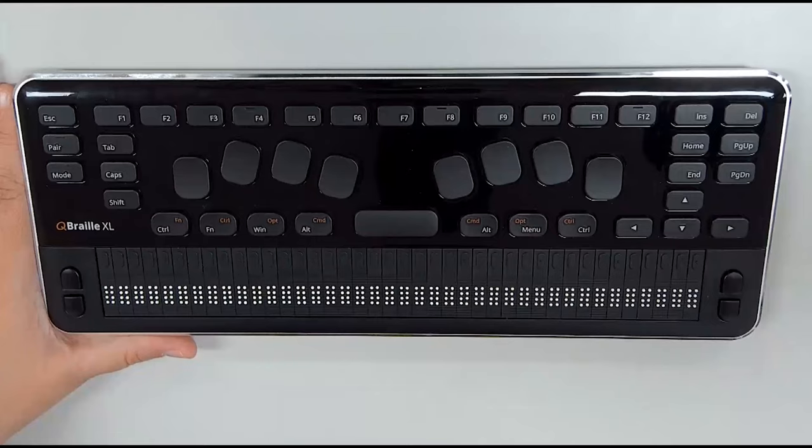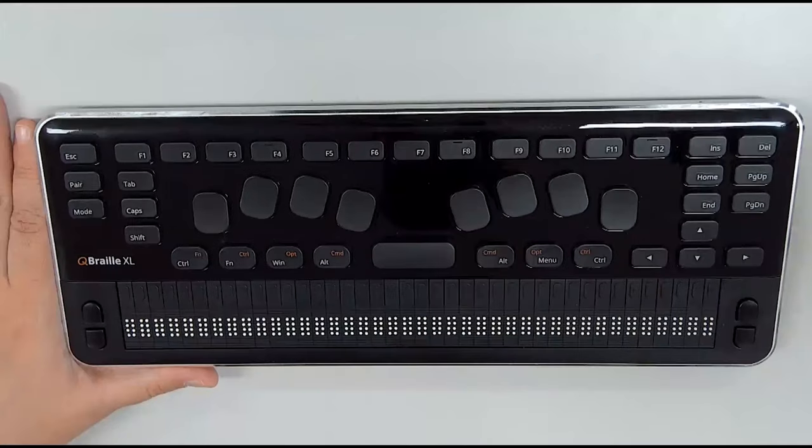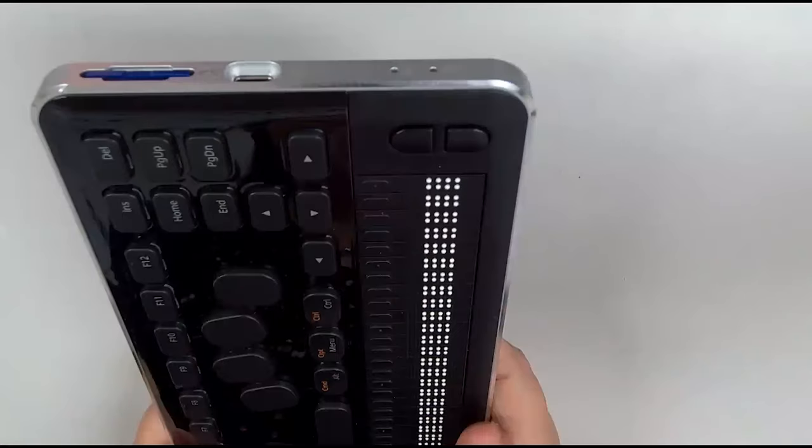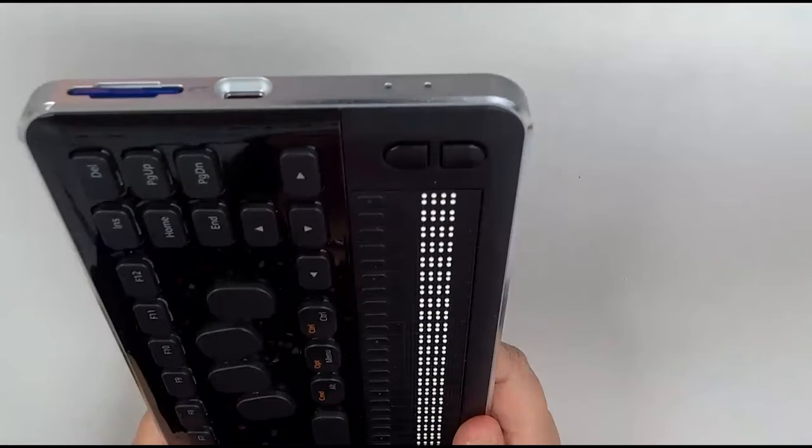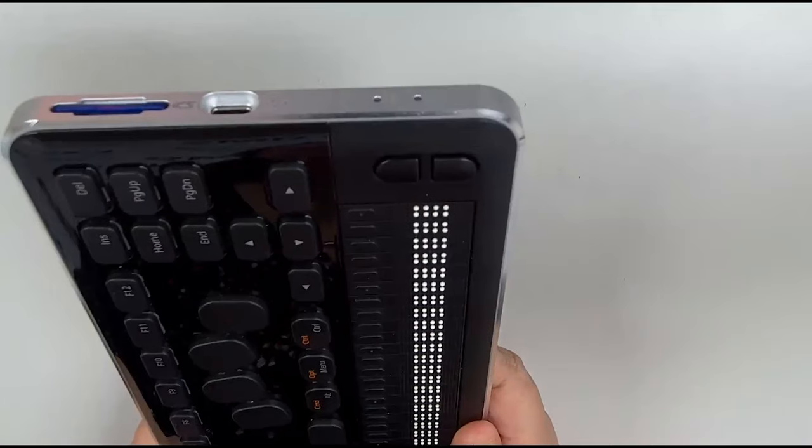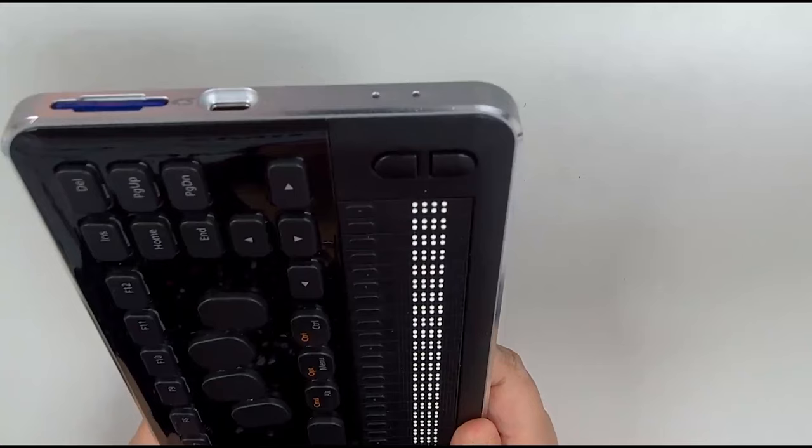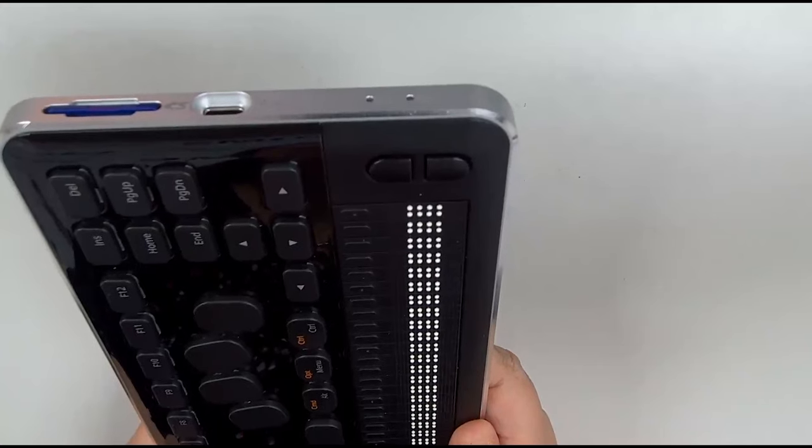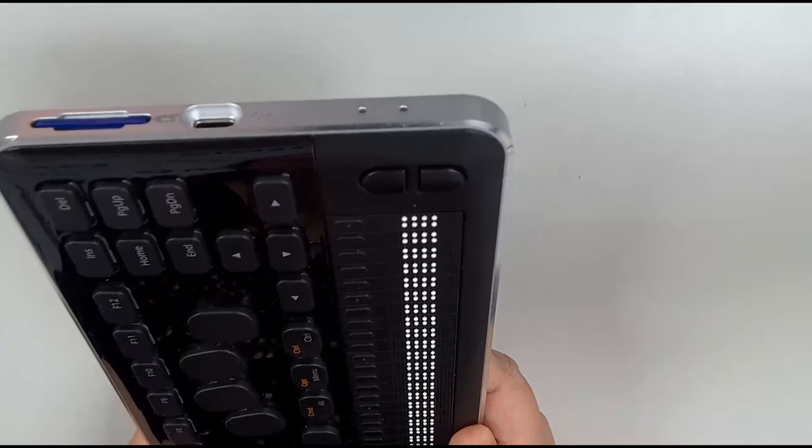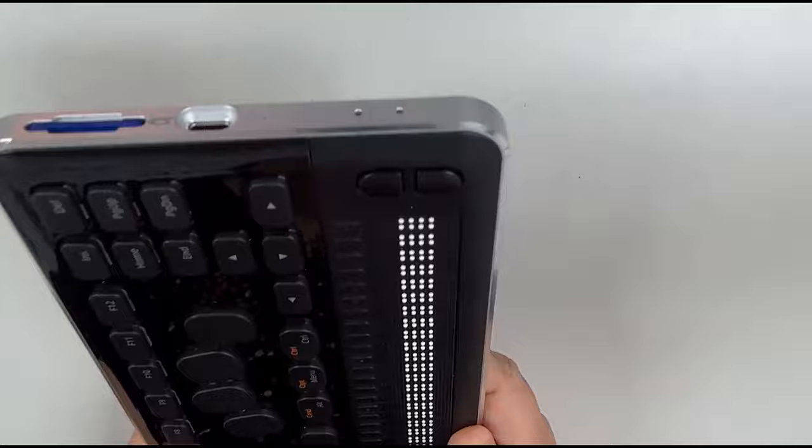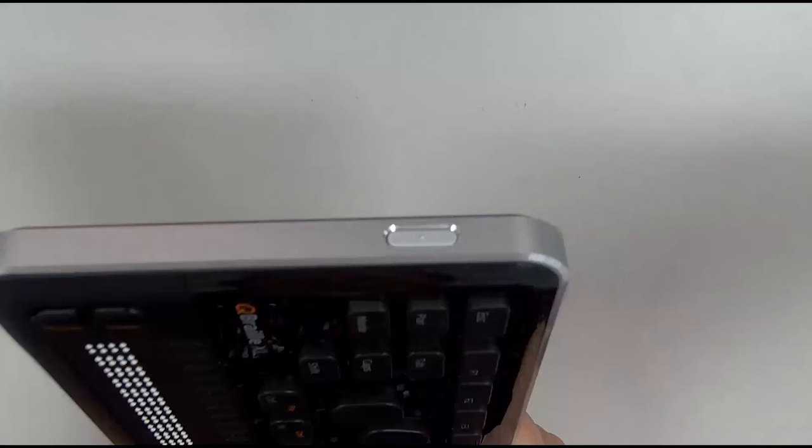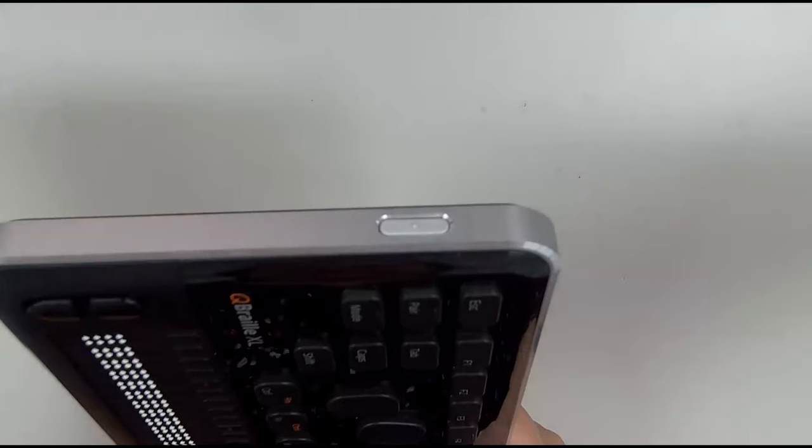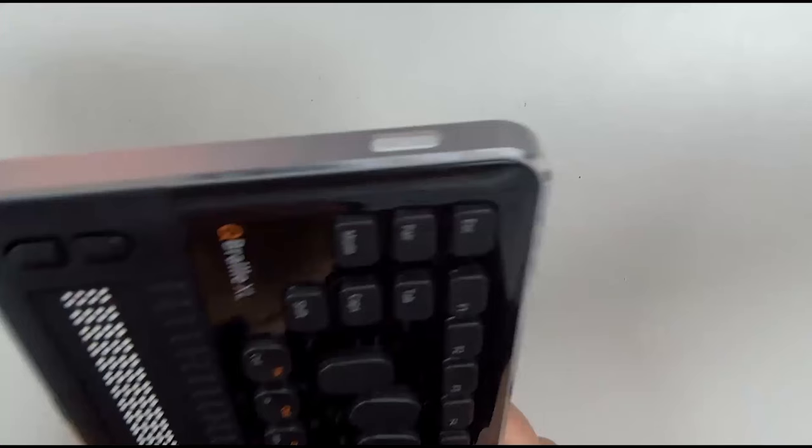And to the left of those, we have a couple of Q Braille-specific keys. We have the Mode key, the Pairing key, and above those is the Escape key in its normal position. Across the top, then, we have the usual F1 through F12. So moving around to the right edge, we have the SD card slot, which we use to store notepad documents, Daisy books, appointments, and your Q Braille settings. In front of that, we have the USB-C port, which we use to charge the unit, transfer files via mass storage mode, and, of course, to connect as the USB Braille display or keyboard. If we move to the left edge, we have only the power button, which has a dot on it as it's very flush with the unit.